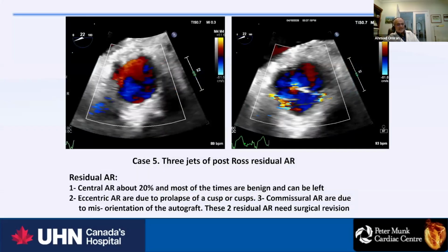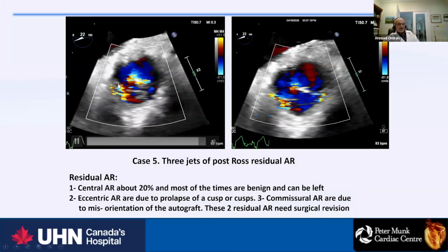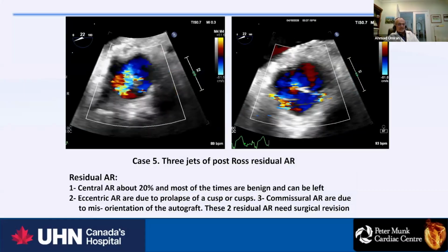This is another case. It's not the same case. This is another case that in post-op developed central AI and commissural AI. And again, we went back and we fixed it. I'm just showing 2 complications. It doesn't mean that every case has this complication.